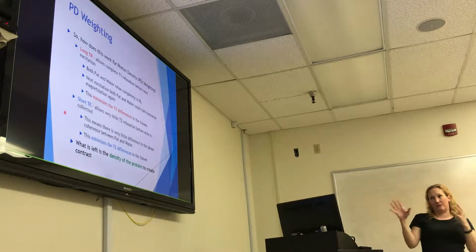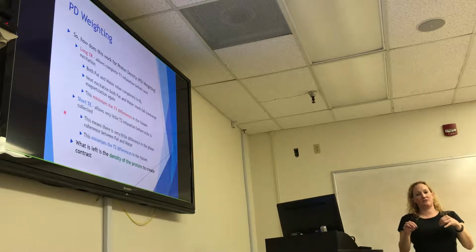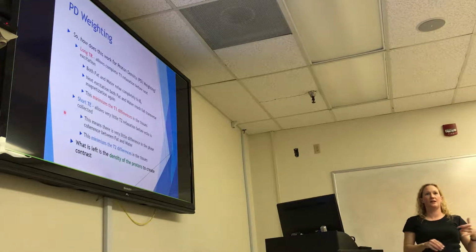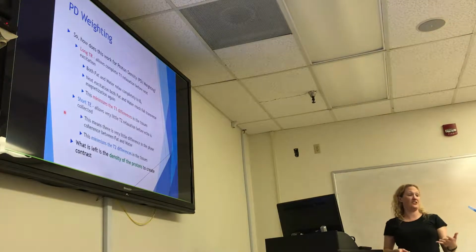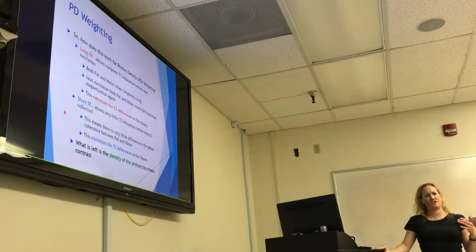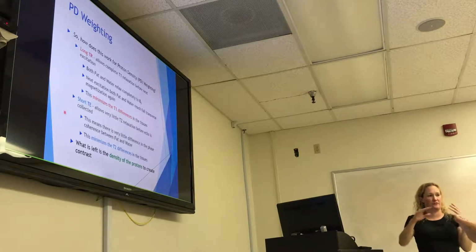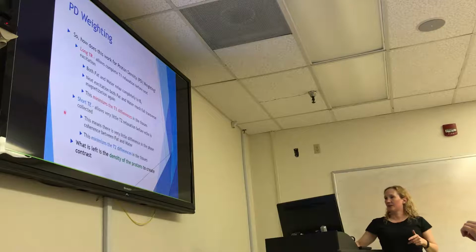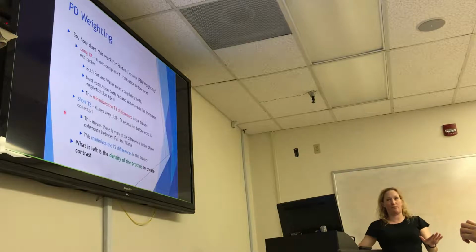And again, all these three different types of weighting, they're all used to diagnose, obviously, and they all show different things. And in about, I don't know, 3 more weeks, I think, we'll actually get to how each of these is displayed, or how the tissue is displayed for each of these types of sequences. That was a homework question that I'm going to table until that lesson, because I actually will have a pretty detailed map out of what tissues do what for whatever particular weighting. So at any rate, we're going to suppress both T1 and T2 properties here.